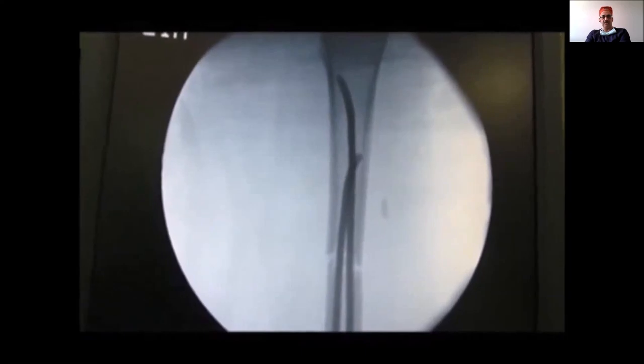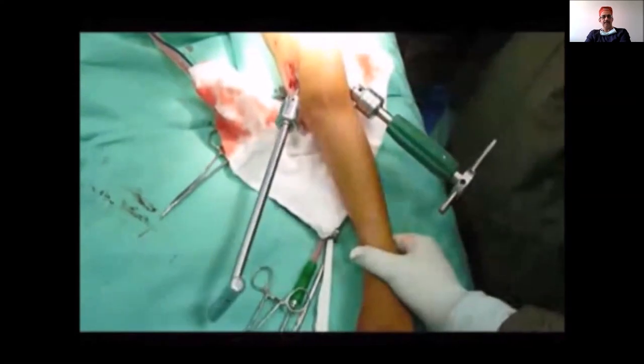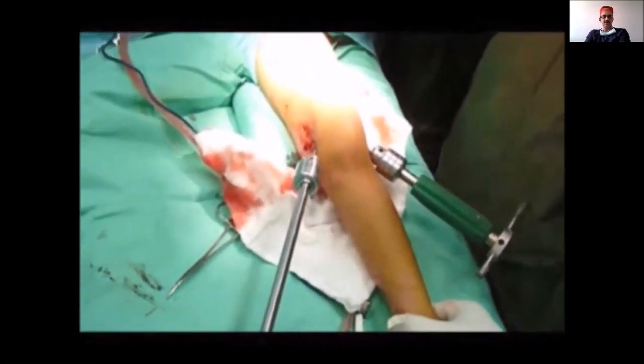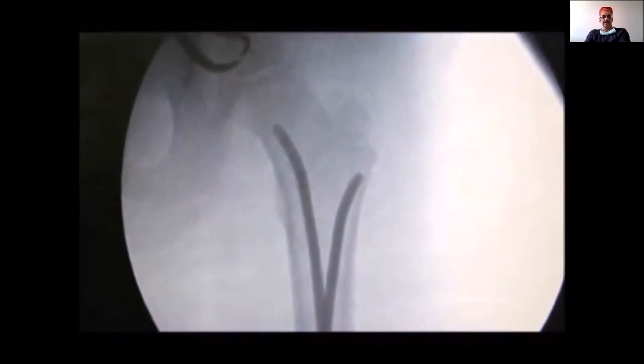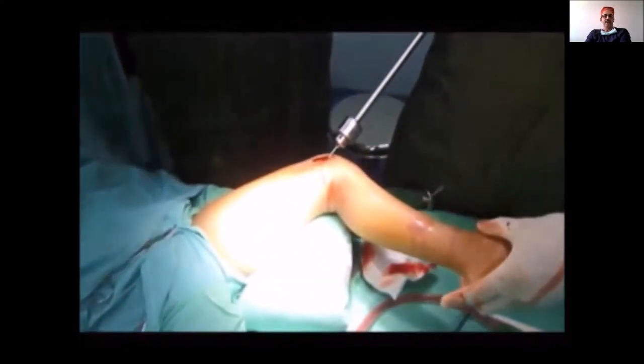With gentle movements, pass the medial nail up to the lesser trochanter and the lateral nail up to the tip of the trochanter, so you don't injure the trochanteric physis — stay short of that. Confirm the reduction and placement. The medial nail can go up to the neck because more metaphyseal bone is available there, and the spindle has formed perfectly at the apex where we expect it to be.